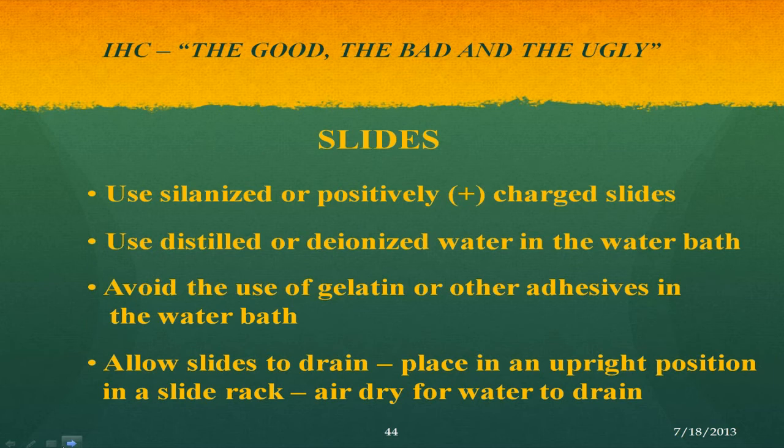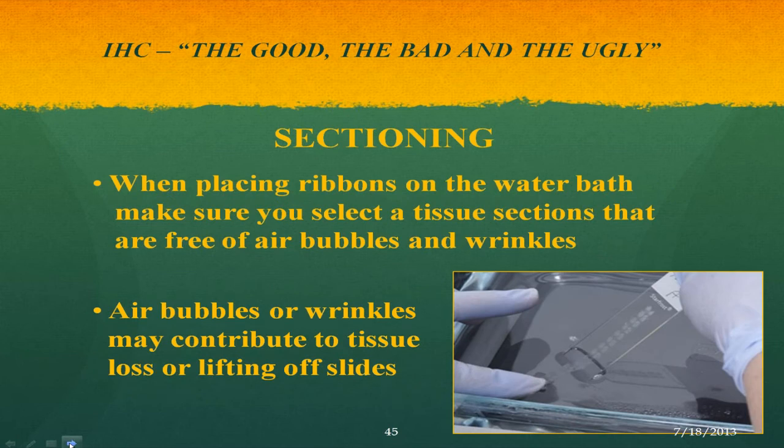And you always want to make sure that you allow your slides to drain. Everybody does it different. They do it in their own way. But sometimes just standing them up and letting them air dry, or if you have a small little fan that you can purchase at Walmart or Big Lots to dry your slides. You want to make sure that your slides are dried before putting them in the oven.